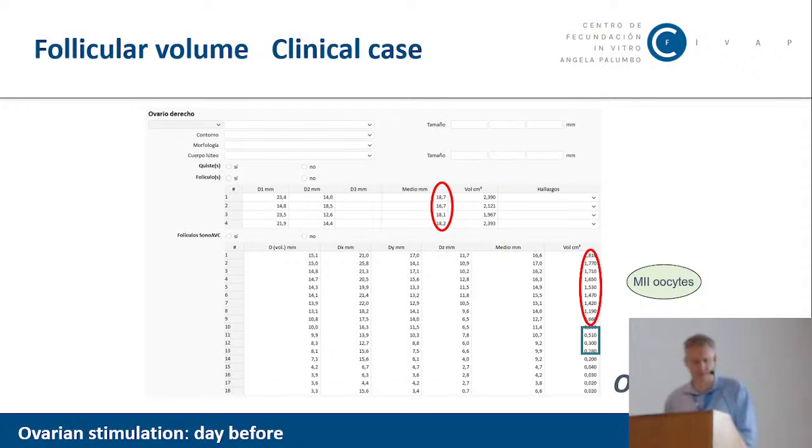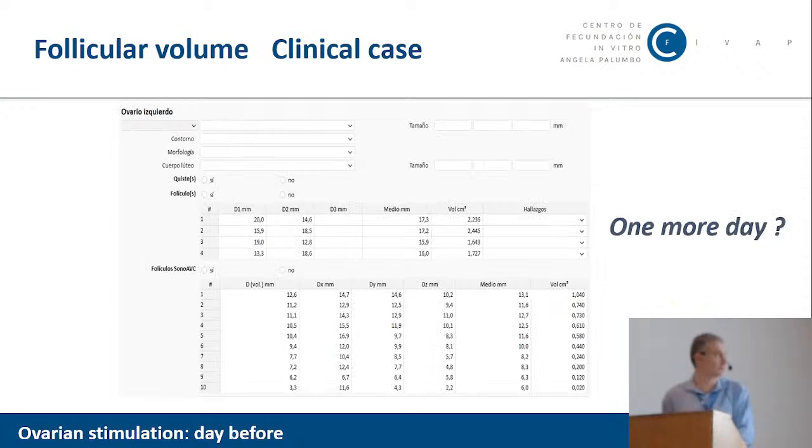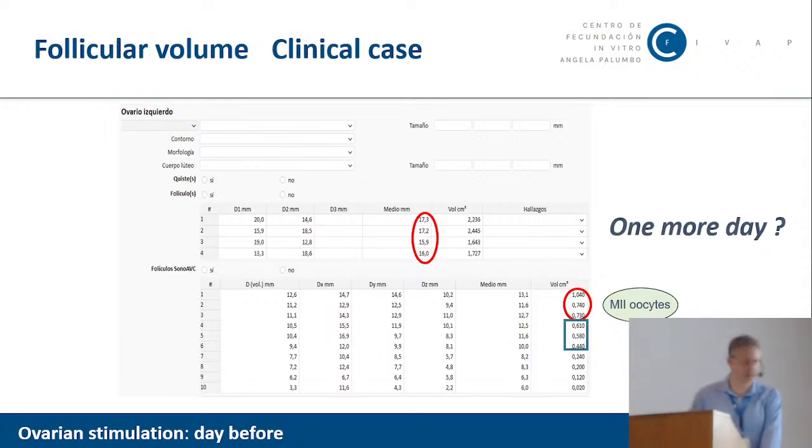This is the other ovary. It's the same. You have a different follicle, and I have a follicle with this volume.